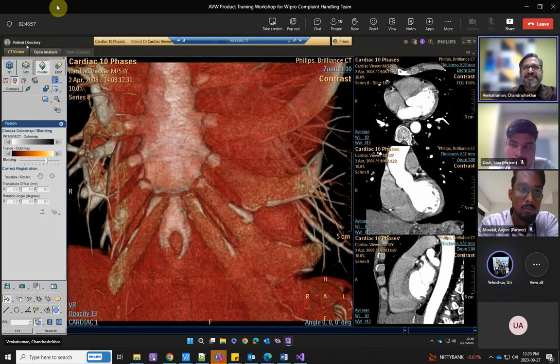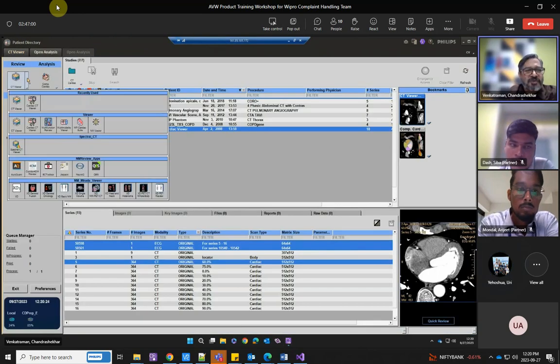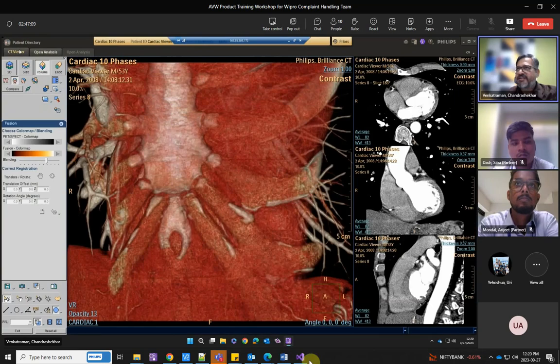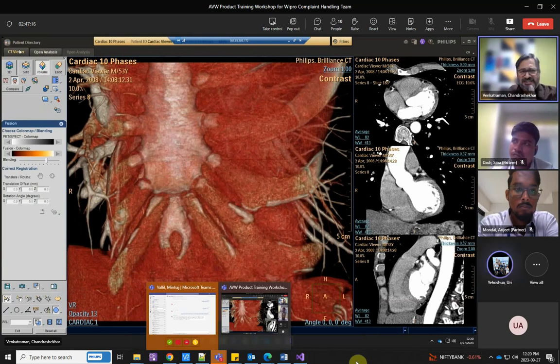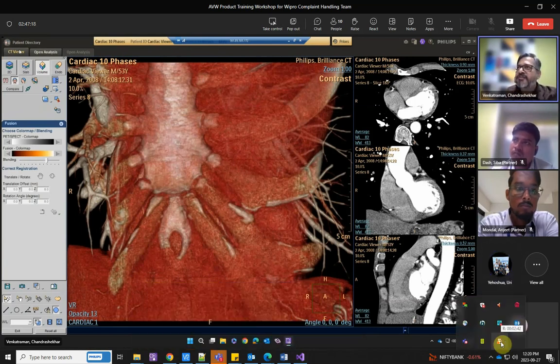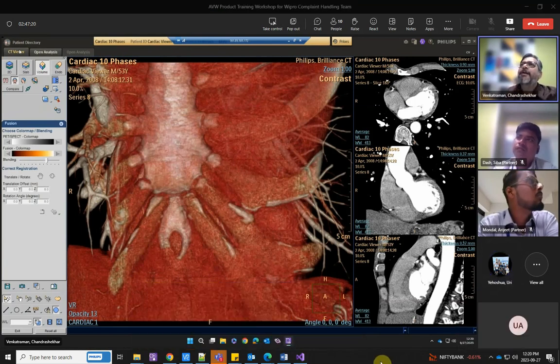Of course, for PET CT or NM, most often it is the NM viewer, or nowadays the Mirada, which is more recommended. We also have the erstwhile NM viewer still available in ISP, but that's the one more used for NM planar, SPECT, PET CT, etc. But CT viewer, of course, is more used for CT and MR. But the question is if it's validated, if we officially allow the user to use it for MR, for example.